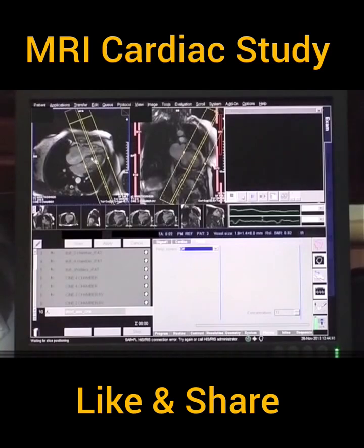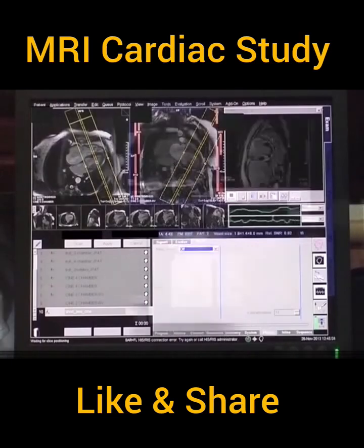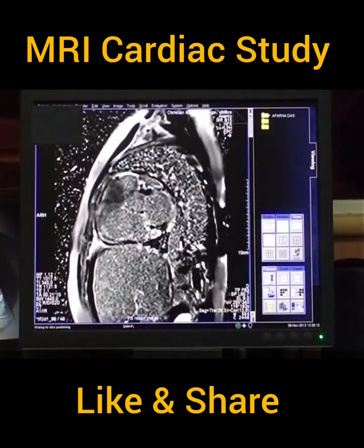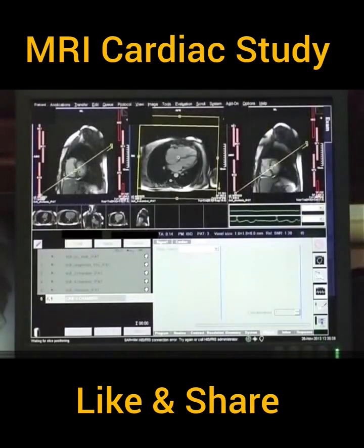This is the planning of the short axis, where slices are taken perpendicular to the interventricular septum. Both magnitude and PSIR images are obtained. These are the magnitude images and these are the PSIR images. This is the planning for the 4-chamber plane. The line passes through the RV apex and the anterolateral papillary muscle.